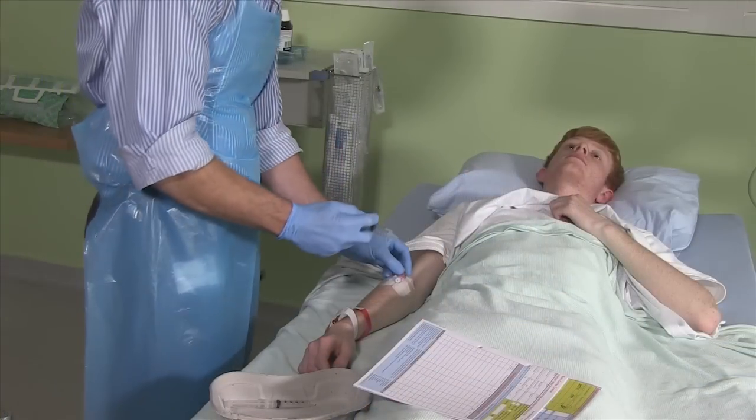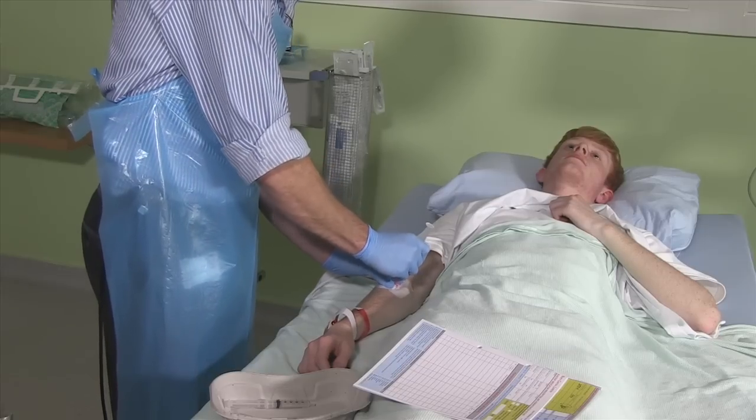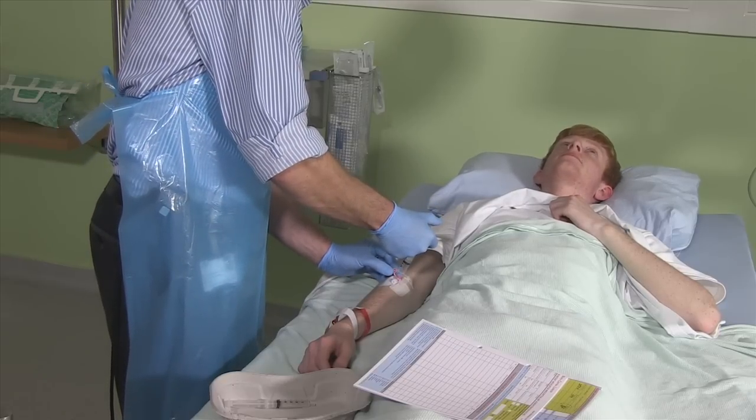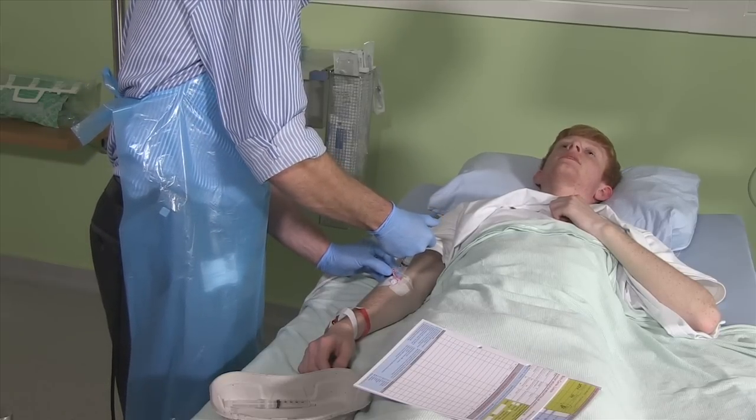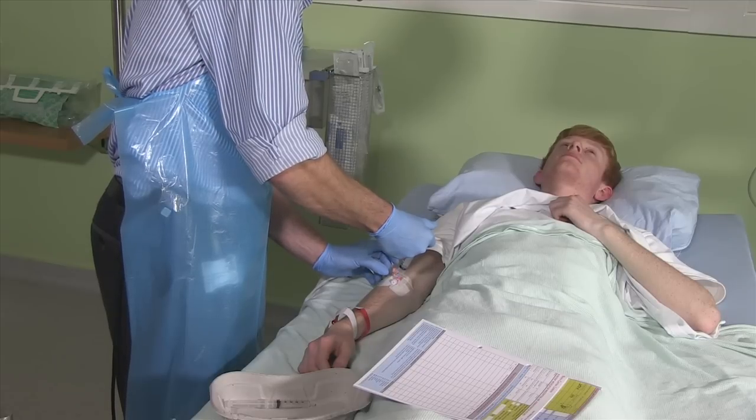When you're happy, slowly inject the antibiotic watching the patient for any adverse signs. Also watch the cannula to see if the injection leaks into the surrounding tissues — if it does, stop. Talk to the patient as you give the drug: 'Just giving the antibiotic now.'